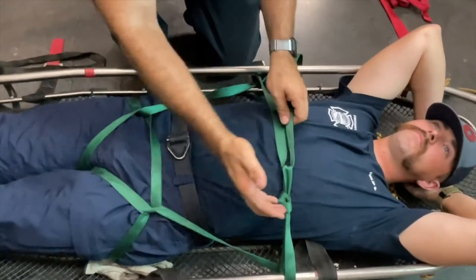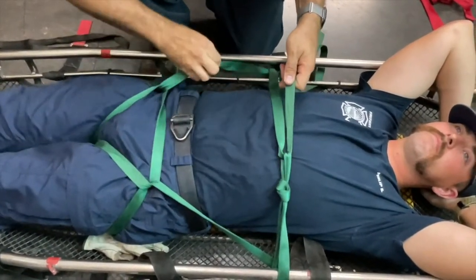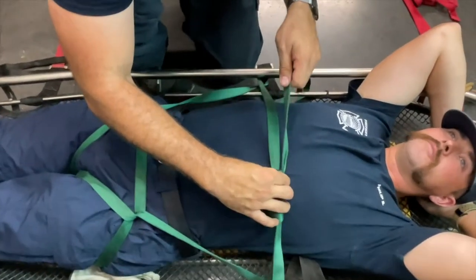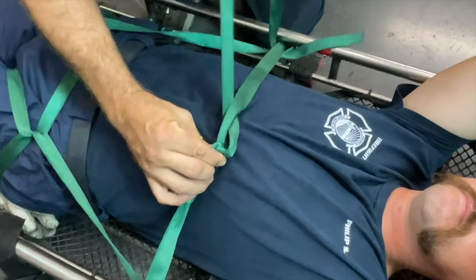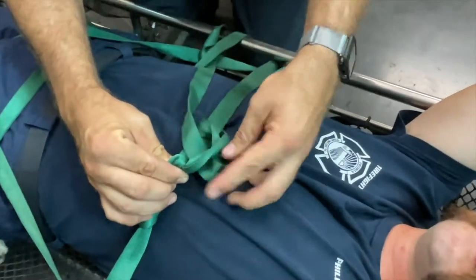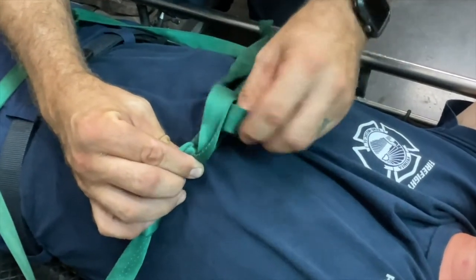We don't want to pull it too hard and cause the patient discomfort, but we do need to take the slack out so that the patient doesn't move in the basket. Take a deep breath, pull it tight, pinch it there, go ahead let it out. At this point you can finish with either a full overhand — taking the entire tail through the hole — or pinching it, you can do a series of half hitches.